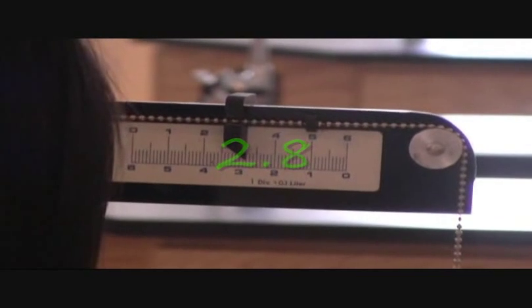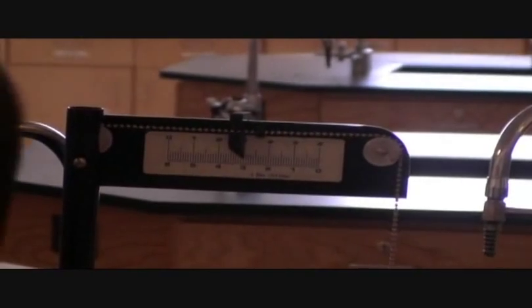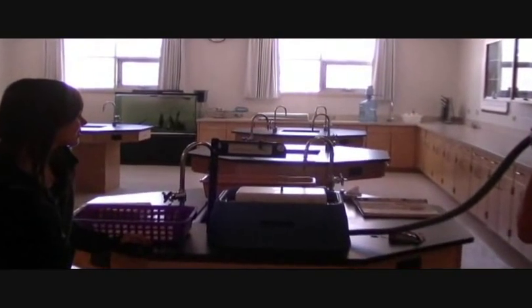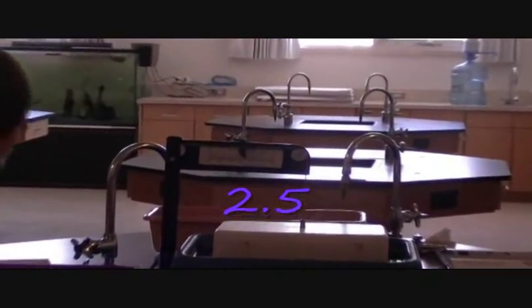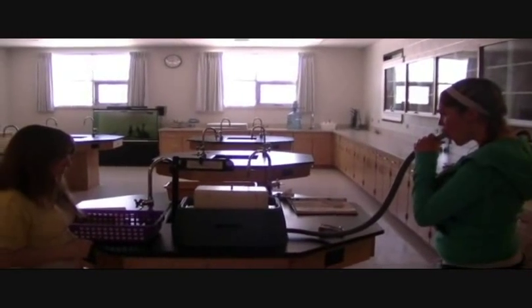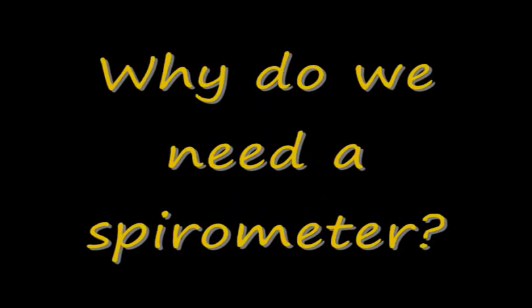Two point eight. Three. Two point five. Three point six.